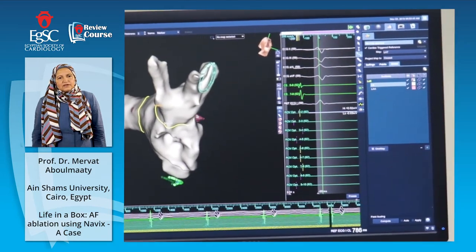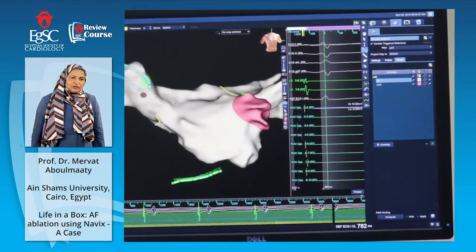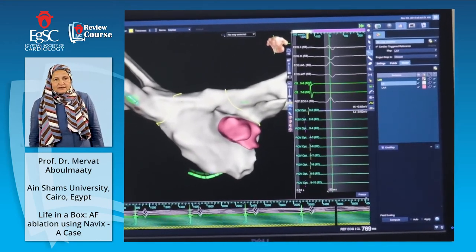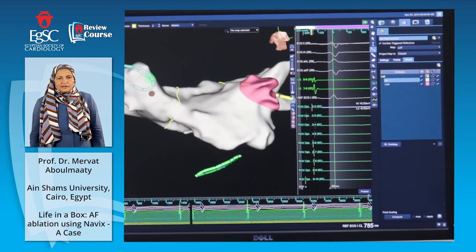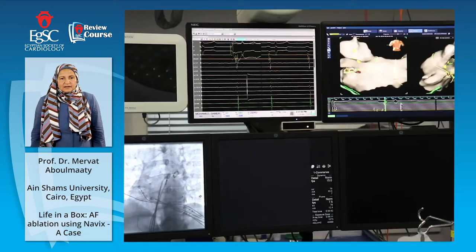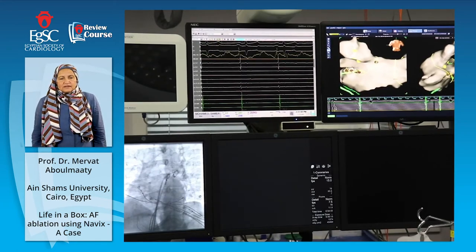As you see, the green light is the ablation catheter, and the circular catheter is seen here. The lower catheter is the CS catheter. We make these lines look nice, and then we start with the left-sided veins.